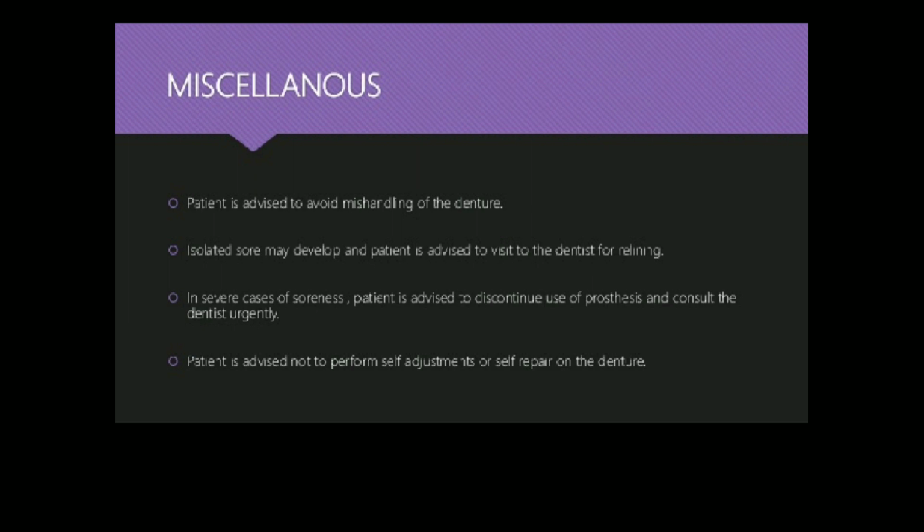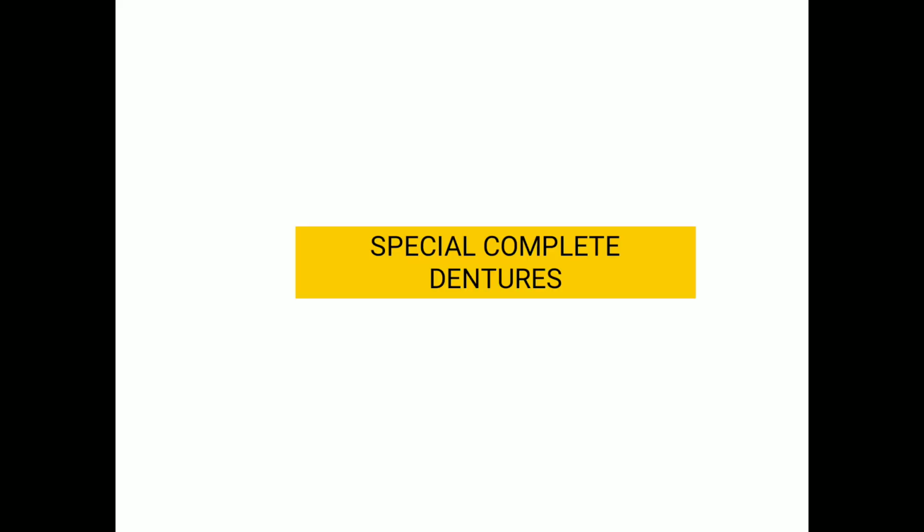There will be some post insertion problems for every denture, in almost all conditions. Even if the edges and everything are good, there will be some post insertion problems. There might be soreness, there might be some slight discomfort. If he is saying some mild problems, that means the patient is wearing his denture. Otherwise the patient is not wearing his denture, just keeping it in an almirah or showcase, right?